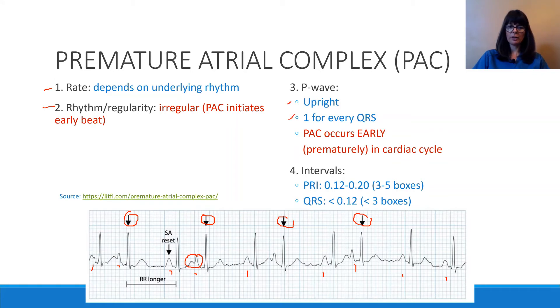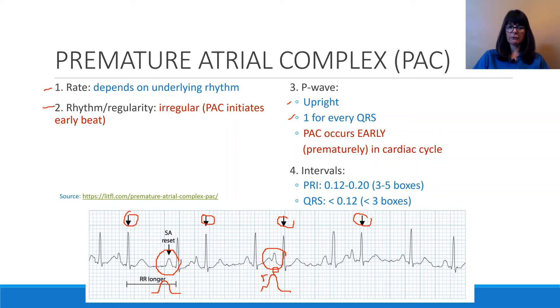Then we have these early beats. Sometimes, because the impulse does not come from the SA node but from a different location, the P wave will be shaped a little bit differently. Comparing a regular P wave to one of the PAC P waves, you can see the early one has kind of a little notch in it — possibly the T wave from the previous complex merging with the P wave — and it certainly looks different from the regular beats. This is the PAC occurring early in the cardiac cycle.